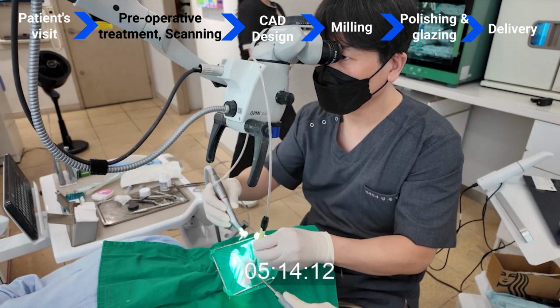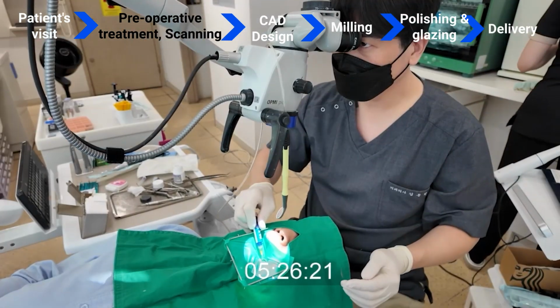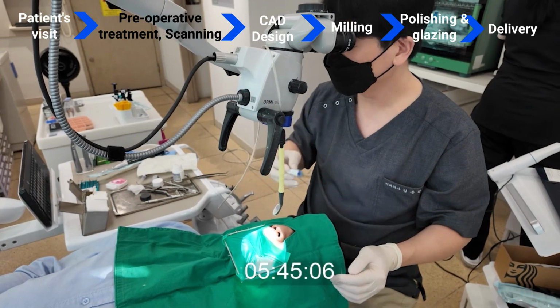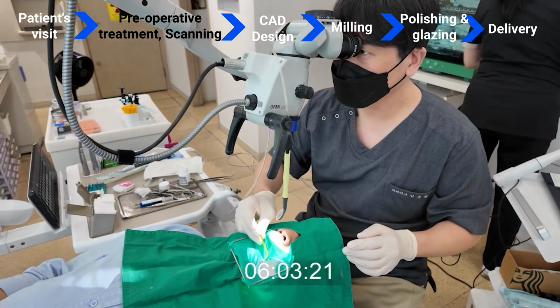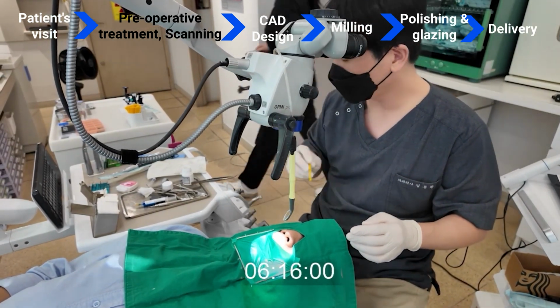Next, we use a handpiece to clean the area thoroughly. We then apply etching with a micro brush to ensure good penetration.